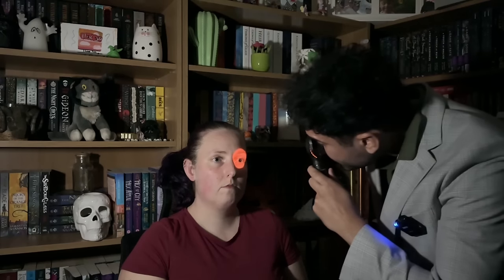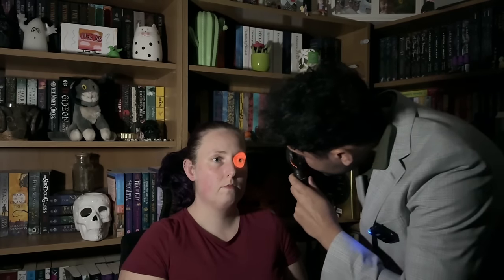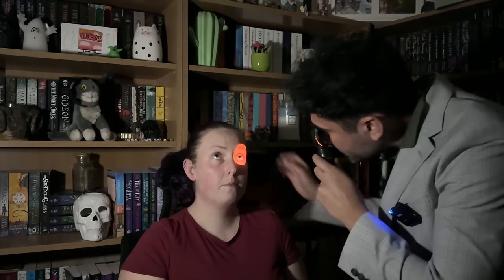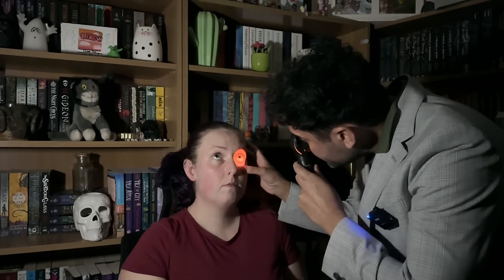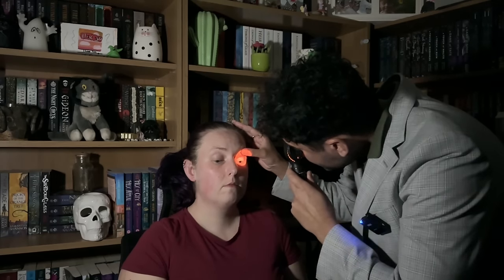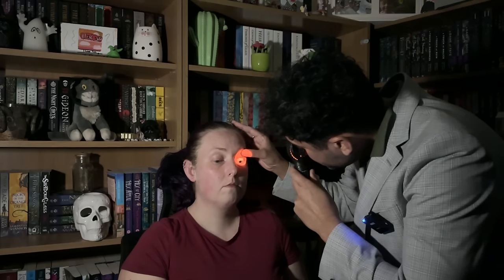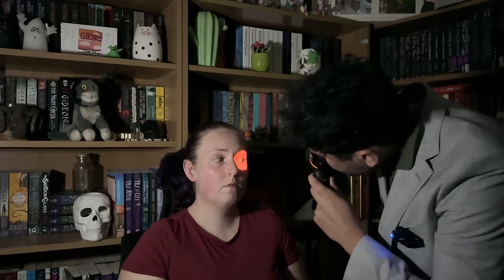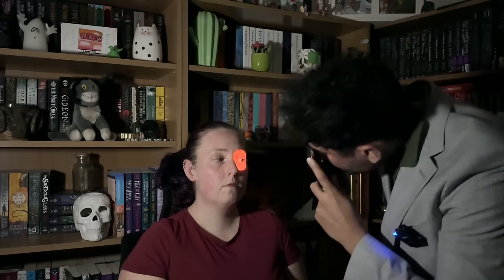So now performing ophthalmoscopy on a patient and the left eye — I'll use my left eye for her left eye. I want the patient looking straight ahead at one point to begin with. Just look down, checking the lids and lashes. Look up. Don't be afraid to lower and lift lids — you're going to miss any potential pathology up to the surfaces. Look to your right hand side and left. Straight ahead again.